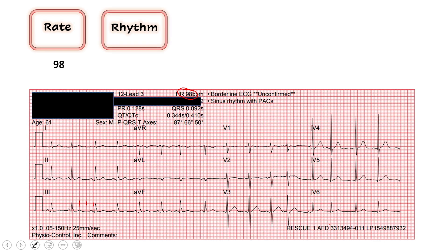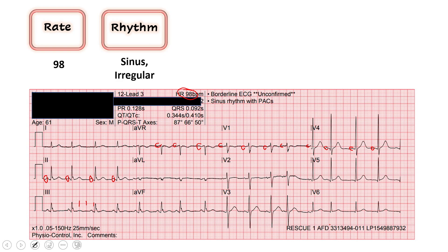Moving on, next we assess our rhythm. The two questions we ask are: is it regular, and is there a P wave before every QRS? This is going to be our learning point today. I would call this a sinus rhythm — we look for P waves before every QRS to determine if it's sinus. Lead 2 is going to be your best place to see your P waves. I see those here, and if we follow it throughout the precordium, I see P waves in front of pretty much every single QRS complex, so I would call this a sinus rhythm.